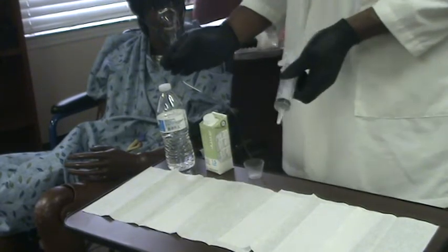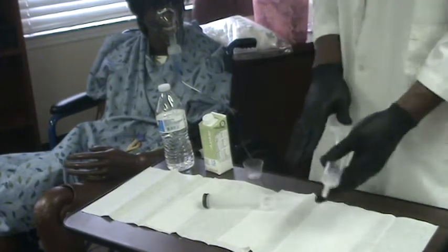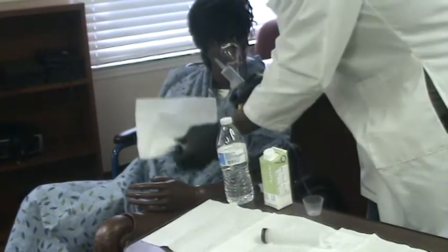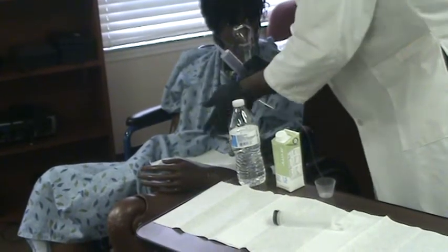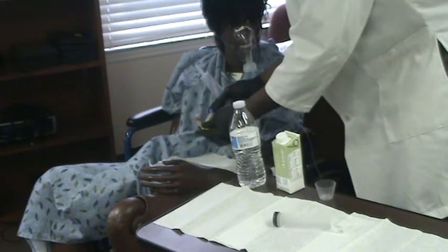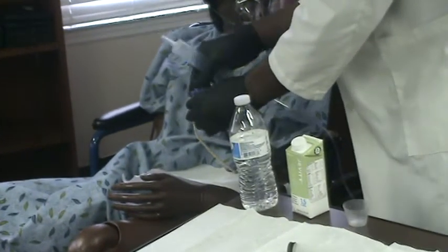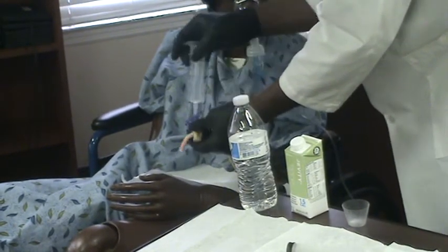All right. So you're going to open your feeding tube. Always put a barrier on the table. Sometimes it's also a good idea to put a towel nearby in case you have drops, so they won't drop on your hand or gown. You're going to bend this up before you open. If you open it without bending, the content of the stomach can end up in your face. So bend it, open it, insert the plunger.